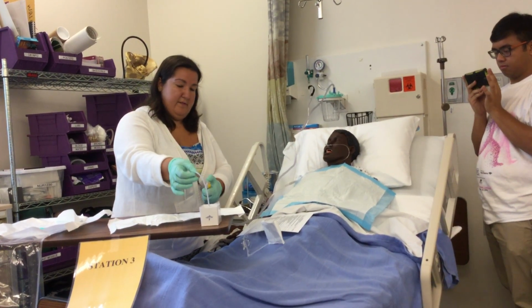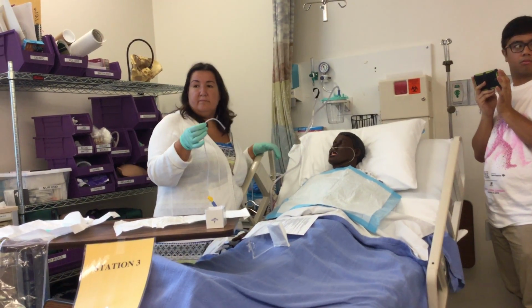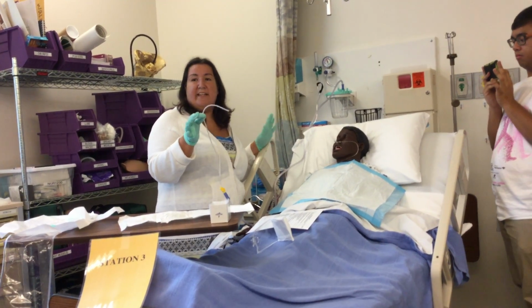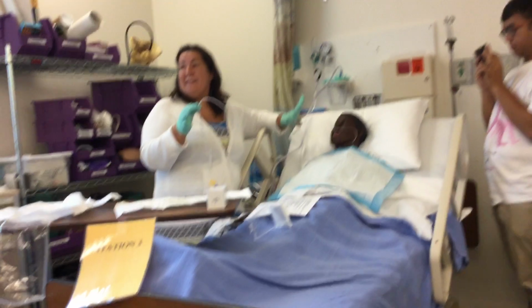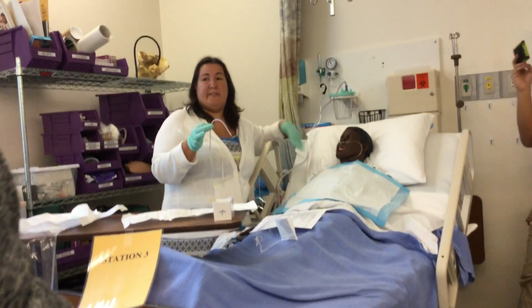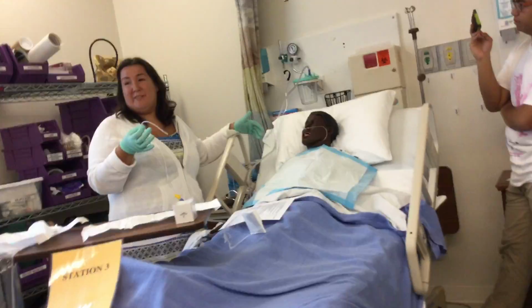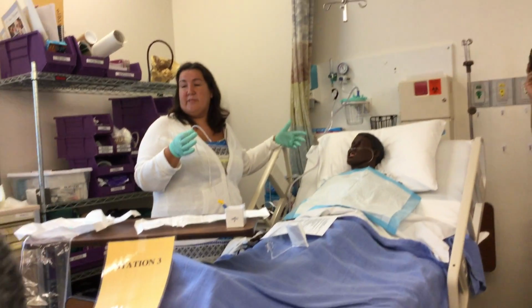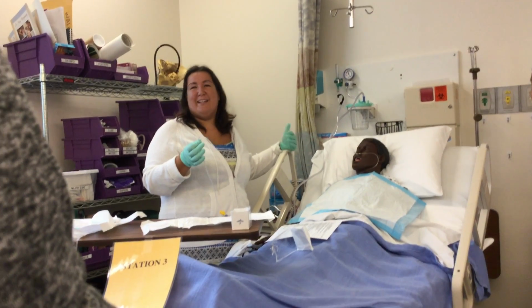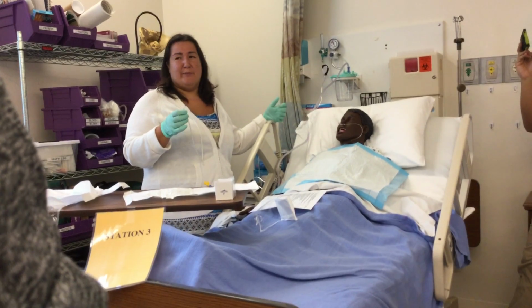Have them recover. Is your right hand technically sterile now, or is it okay because it's only got germs related to the patient suctioning? Yes. So it's still technically sterile. You want to keep it sterile and it's only got the patient's germs. The patient's germs are already there, so we're not worried about that. We're worried about putting C. diff, MRSA, other germs into his airway. They're probably sick, so they do have some germs, but really your airway should be pretty sterile. The only germs that are going to be there are whatever germs are making them sick. Well, they already have those. We don't want to add to those germs and put newer, more resistant, better germs in there. That's what we don't want to do.